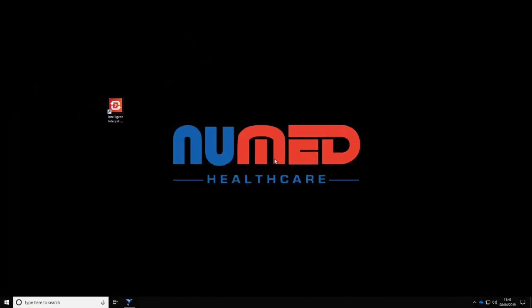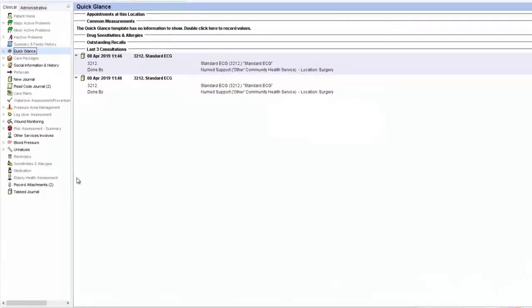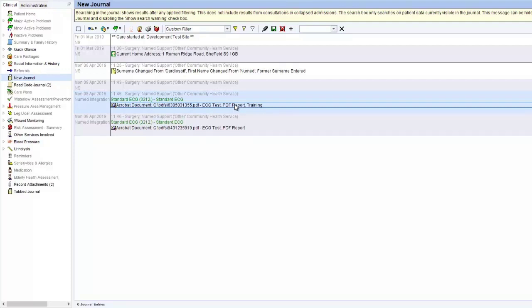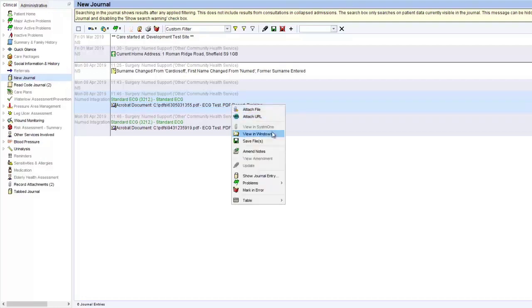Remove the memory card from the card reader and plug this back into the Mach 600. The results can now be viewed in the patient record. In the new journal, you will see that the ECG attachment has been read-coded automatically with a 3212 standard ECG read code. Our comment of 'training' can be seen to the right of the attachments. The ECG report appears as an attachment in a PDF document format. To open the attached result, right-click and then select View in Windows.